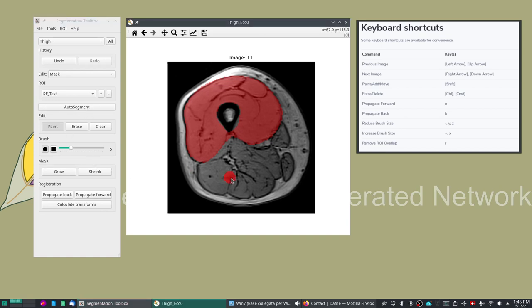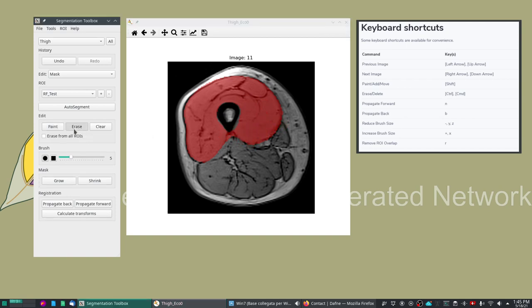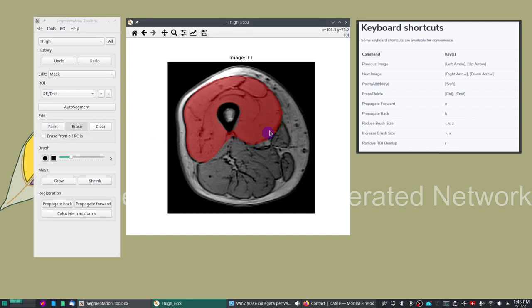Since we are in mask mode let's now also demonstrate how this works. Now the add and move is replaced by paint and the delete is replaced by the erase function. You see the mouse cursor has become a brush and it's a red color when we are painting and it will get blue when we are erasing features.